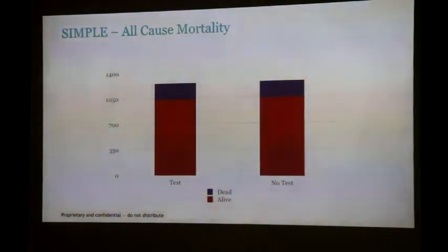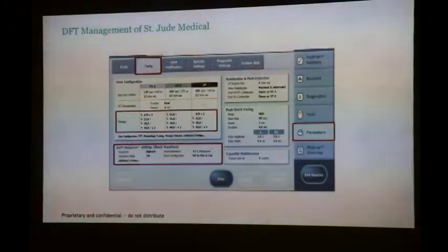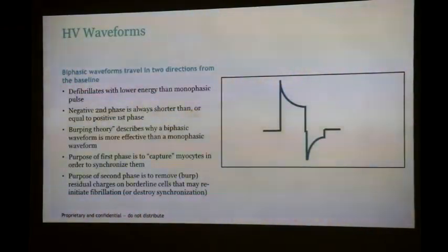Okay. So let's look at the shock waveform stuff. We'll go past that. Shock efficacy, go past this. Okay. So, to make a defibrillator waveform more effective, we can do a number of different things. We can change how long the waveform is. We can change the direction of the current. Let's say we're not moving leads anymore. This is implanted in this patient. We're not going in again. So now we can play with a number of things.